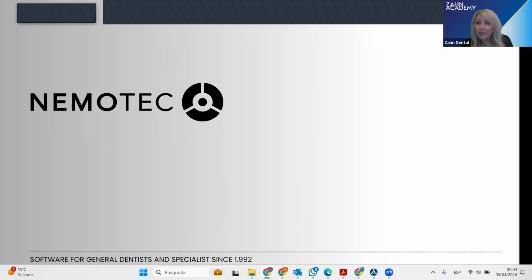Dr. Colón, I have the results of the first poll, and I'm sorry for the typo, everybody. The question was, do you use a CAD in your laboratory? 57% say they do, and 43% do not. I just wanted to let you know what the results were. Thank you so much for answering.